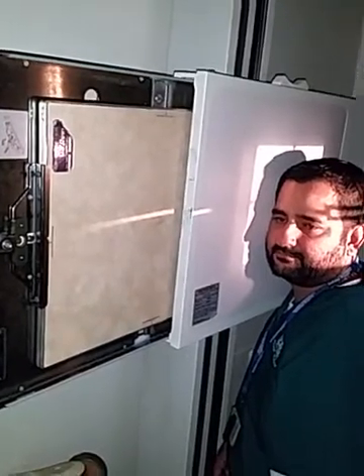You know? So I've seen some situations like this where it could be anywhere on the film. They're like, oh, but it's in the light field. Who cares, you know? Doesn't matter.